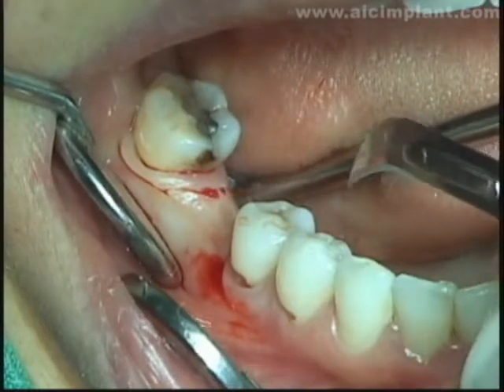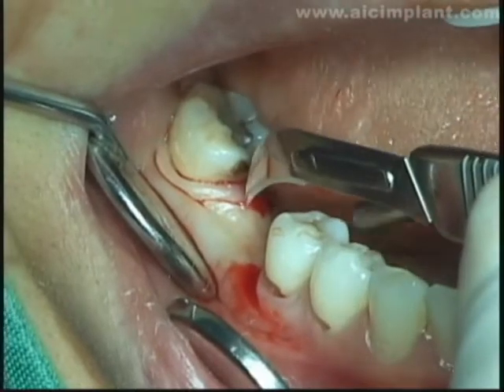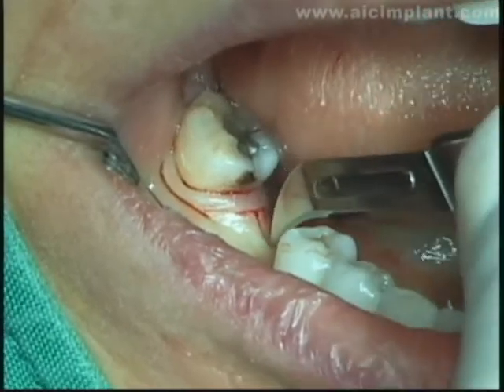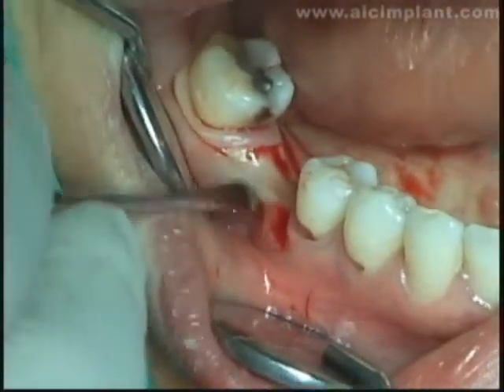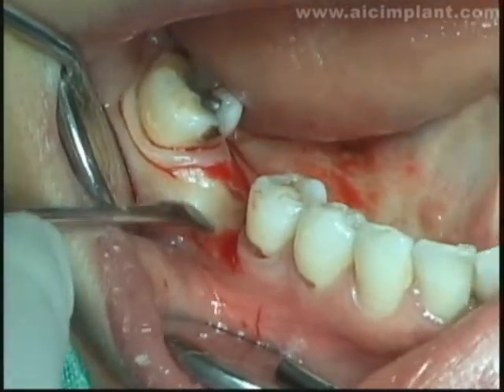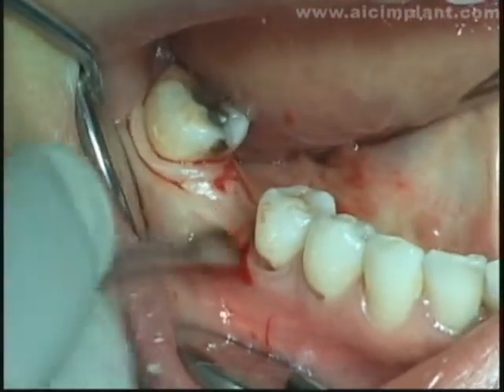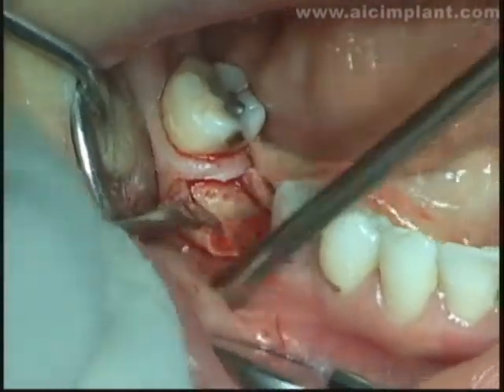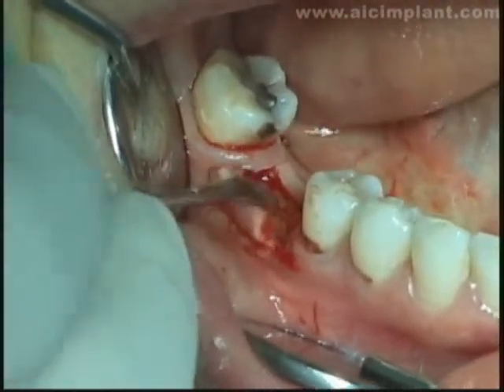The crestal incision is important. The mucogingival junction is here. Thus, to leave at least 2 millimeters of attached gingiva on the buccal side, the crestal incision must be done carefully. If you think it is to be split in half like this, the tissue from here will be moved to the buccal side. Thus, the attached gingiva from here to here can be secured on the buccal side. The flap does not have to be reattached beyond the mucogingival junction. The degree of retraction is sufficient.